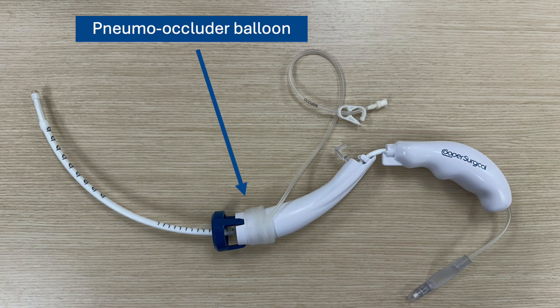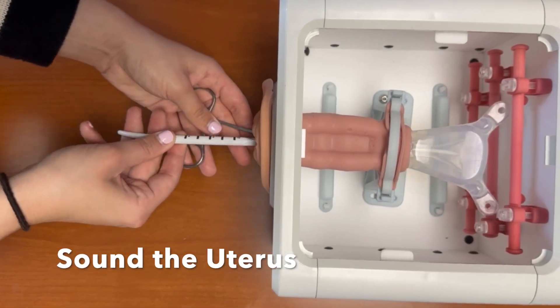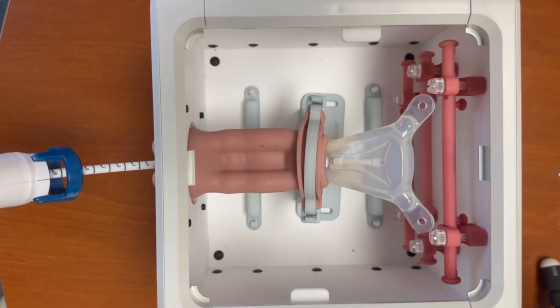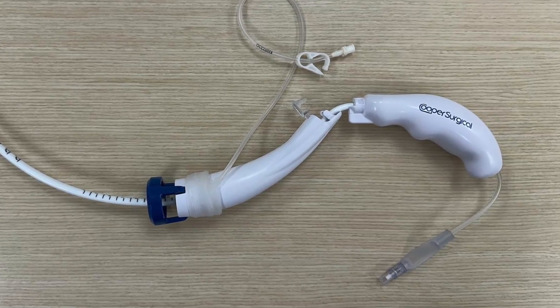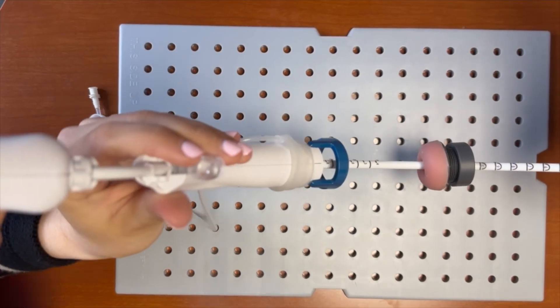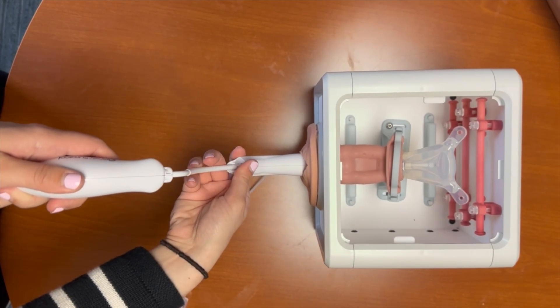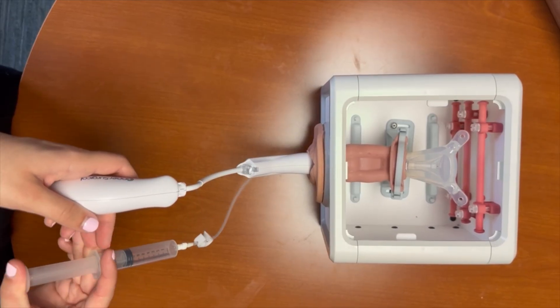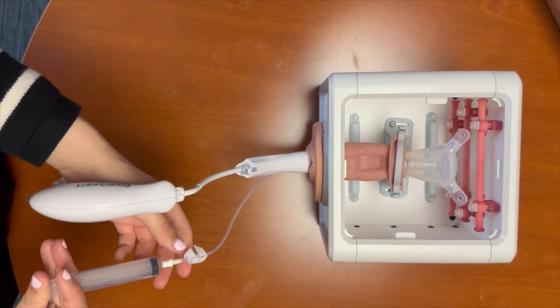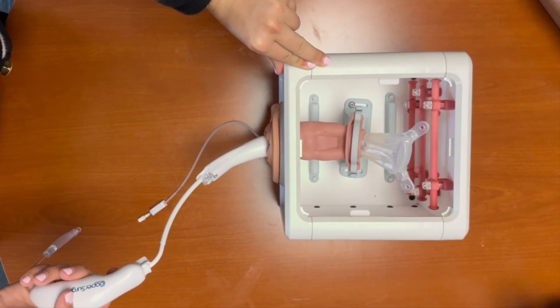The pneumo-occluder balloon is typically packaged with the removable balloon already on the device. We then sound the uterus. To insert the device, we advance the tip to the previously measured depth of the uterus. We then inflate the uterine balloon. Next, we hub the blue cup around the cervix. Once this is in place, we lock the device. Finally, we inflate the vaginal balloon.